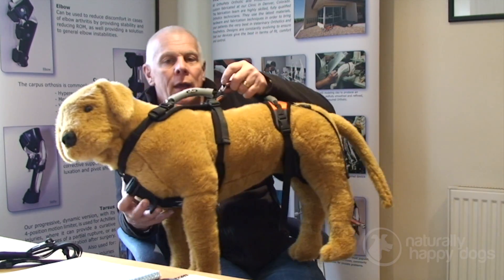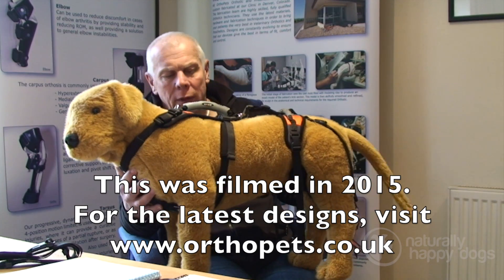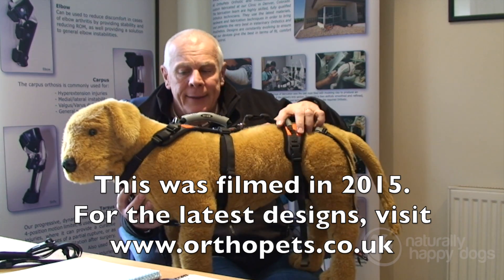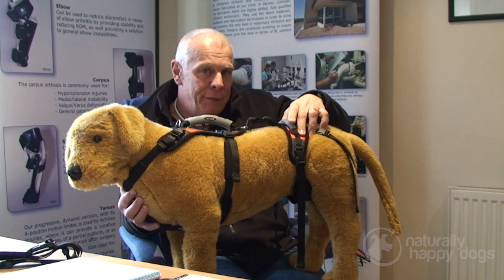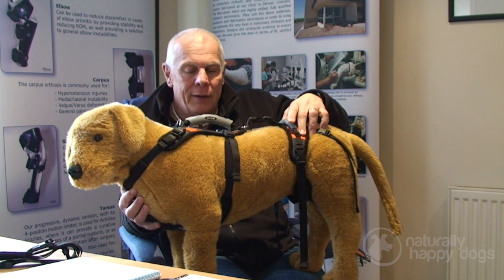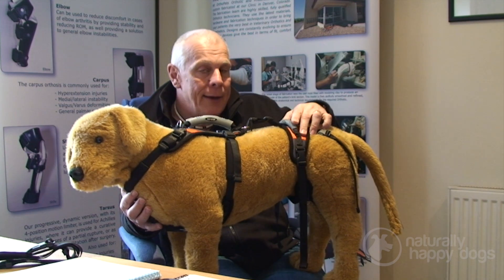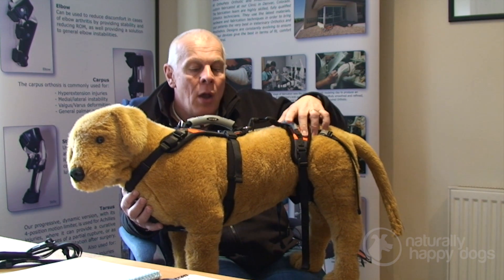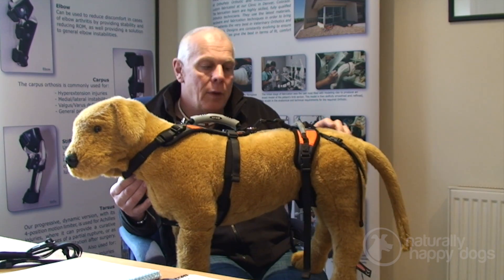Hello, I'm Rod Hunt from Orthopets Europe, and I'm here today to talk to you about the Help Them Up harness. Is it just yet another dog harness on the market? Well, no — this harness has been specifically designed to help with lifting dogs, whether that's lifting them up and down stairs, helping them up off the ground, getting them in or out of the car, or even just helping give them balance and stability when they're on their walk.